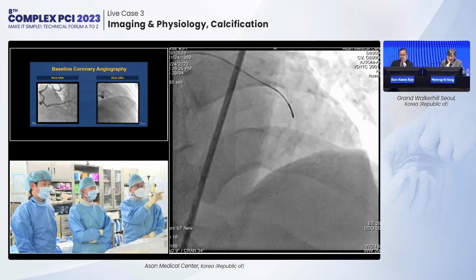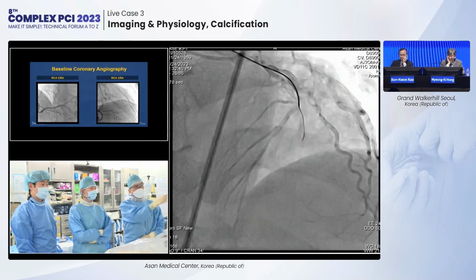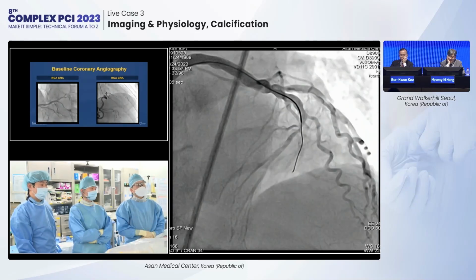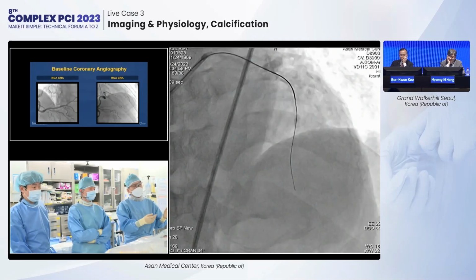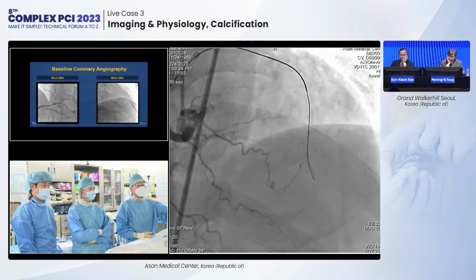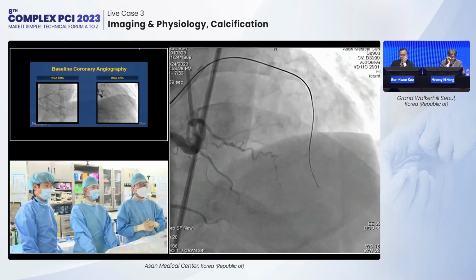And we checked the tip angio, and luckily there was some false lumen remaining. Next. And with the Gaia second wire, we could cross. However, after the crossing, there was no antegrade flow, so we checked the bilateral angio with the radial approach, and we could see that we are in the right way. The CTO itself was not very complex, so it did not take a long time.